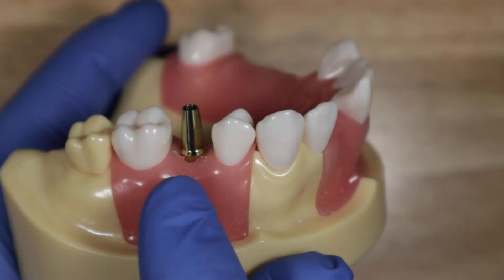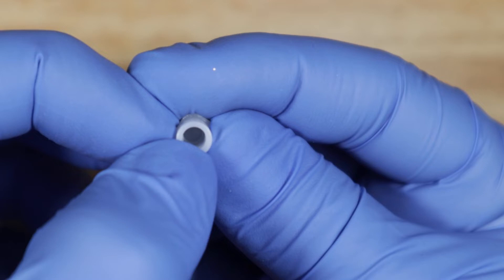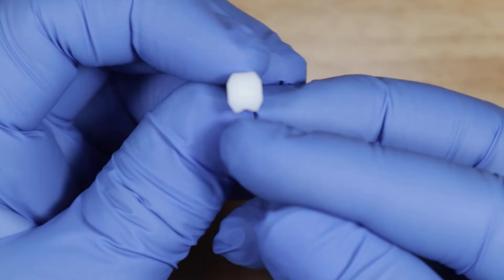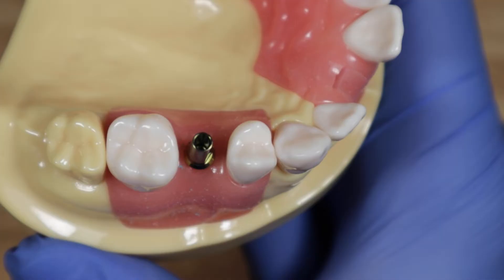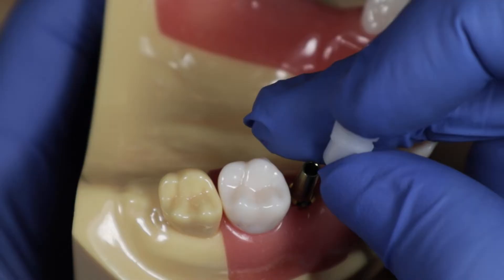Once you're sure this is 100% seated correctly, take the little white cap. Notice it has a flat end on the internal surface, and then it's round. Flip it around — there's a little notch that corresponds to where the flat end is. Take a close look at your impression coping to see where the flat end is. Here it's not straight mesial; it's more mesial-buccal, pointing out this way.